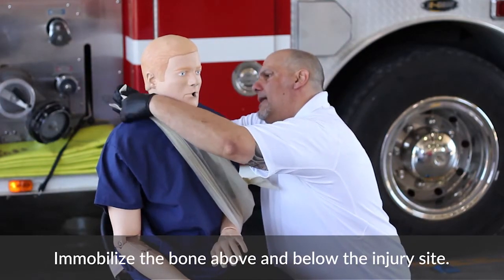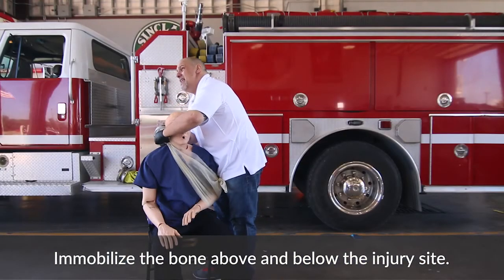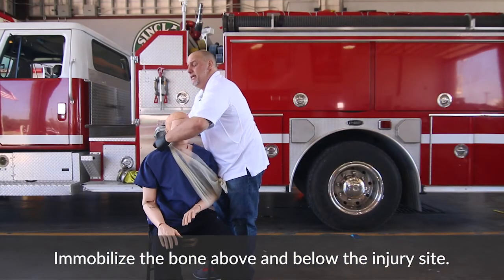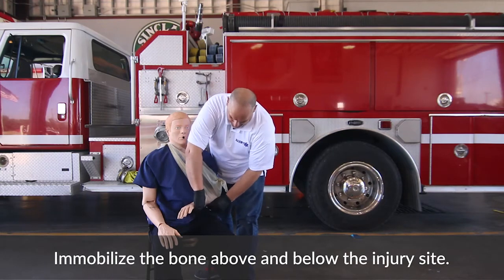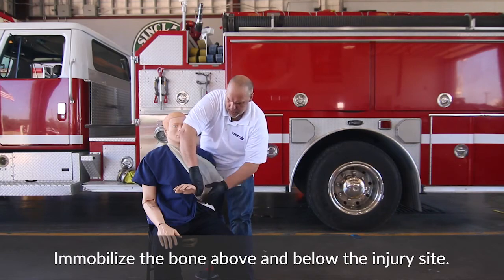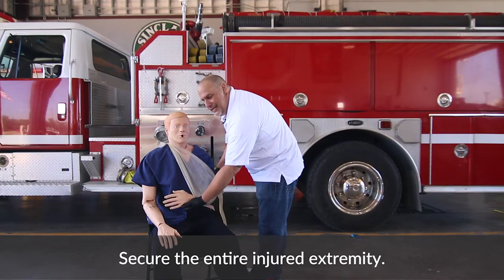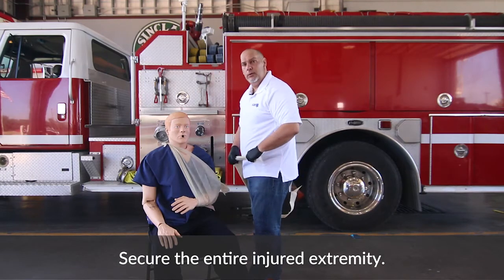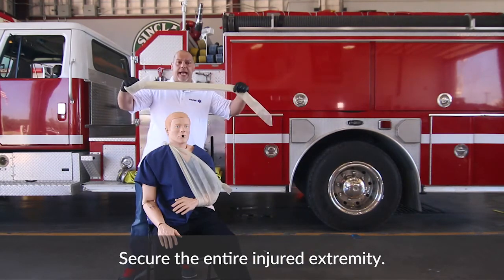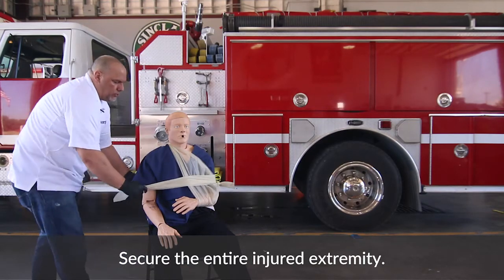You want to go ahead and tie this around the patient's neck. One of the things you may want to think about is putting some gauze up at the top of this triangular bandage to make it a little bit more comfortable. Now that you have the arm sling, you want to go ahead and manually stabilize it. Take your next triangular bandage and don't open it — just put it around the patient's shoulder.